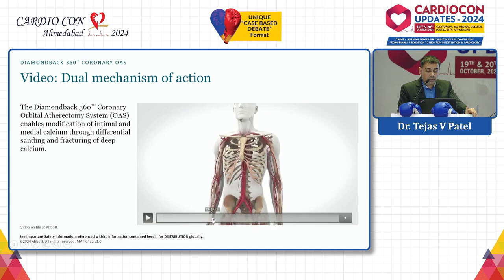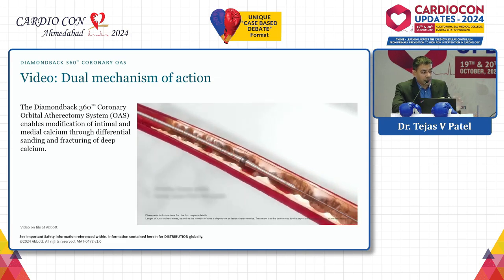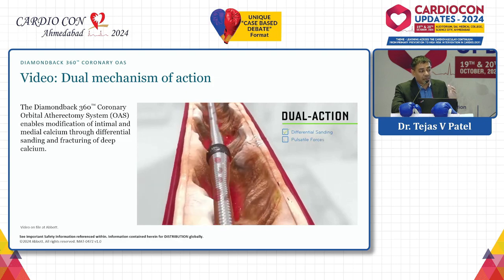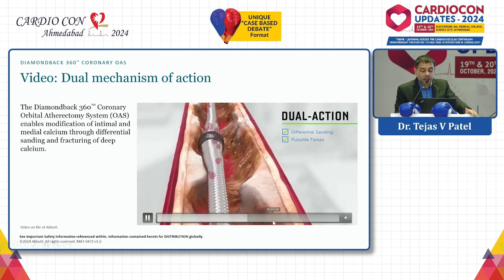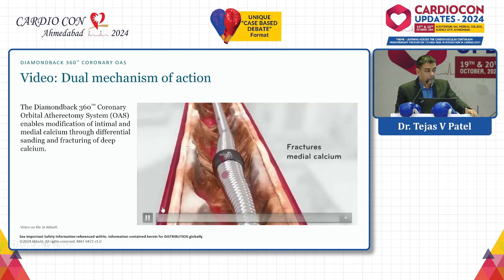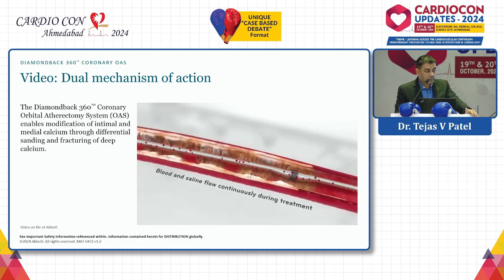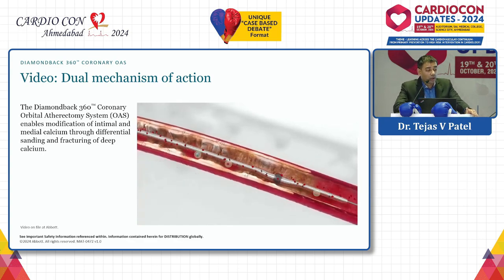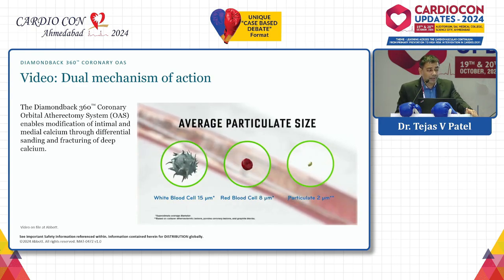And this is the mechanism you can see here. So healthy tissue remains safe because of the differentiating features of the device. And you can see the debulking of the superficial calcium, and you can see the cuts or the cracks of the deeper calcium as well. And at the same time, blood and saline flow continuously throughout the treatment. There is no obstruction of the flow of blood, and that will be very helpful for prevention of slow flow, and the distal perfusion remains as it is.